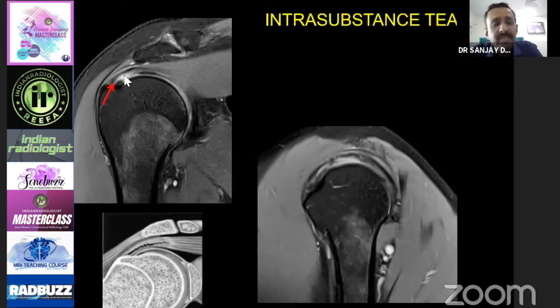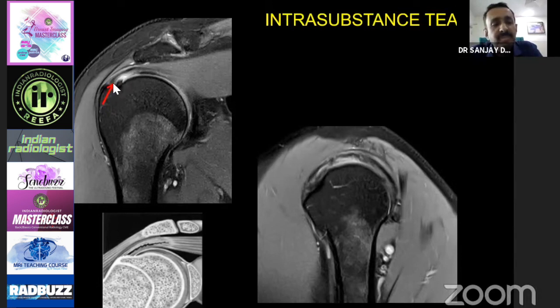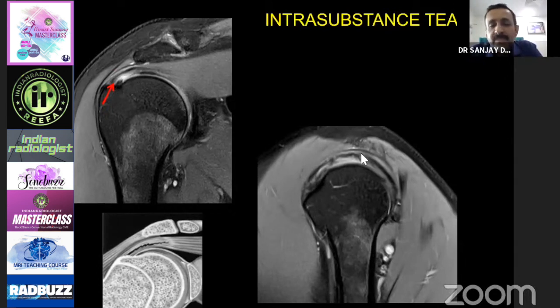The third variety is an interstitial tear. You see an intact black line on the articular surface, an intact black line on top as the bursal surface, and in the center a bright signal as bright as fluid — that is an intrasubstance or interstitial tear. This is how it appears on the sagittal image, and this is the diagrammatic representation.